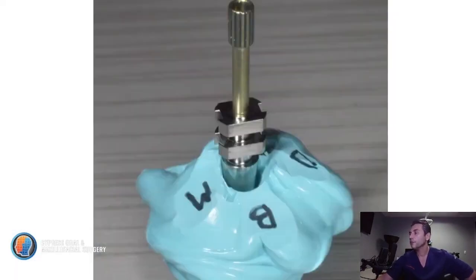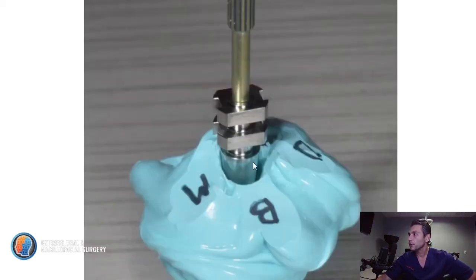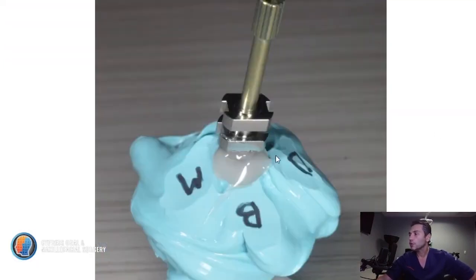And now you have the open tray impression coping in the analog, and you can see the space. There's space between where the gum is and this, and we're going to fill this area here, and even back here if you can, with composite. Here it is. I use flowable composite. It flows very, very well, and then I cure it. And that's what it looks like.